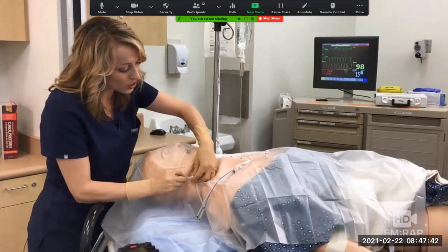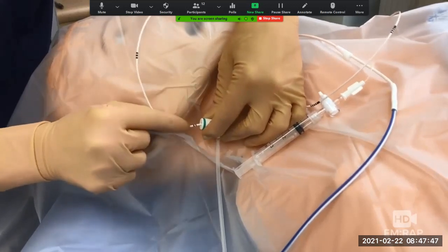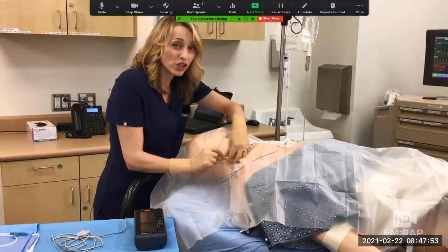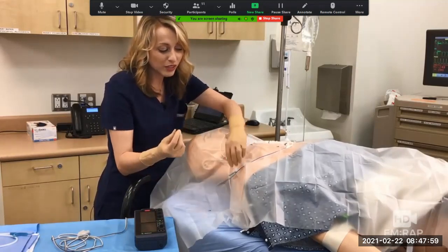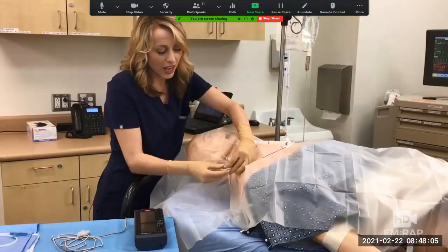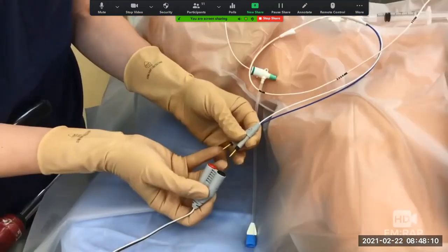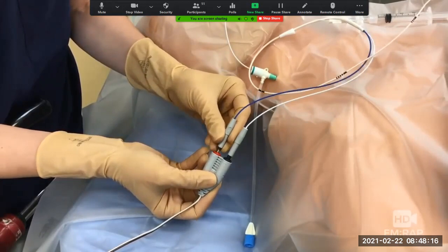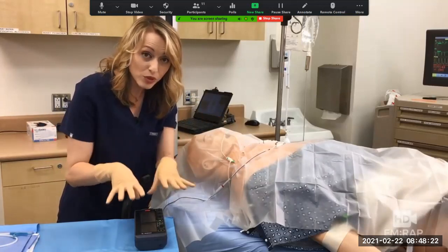So for now, you're going to continue inserting this wire until you get to the 20 centimeter mark, which is indicated by the 2 black lines on the wire. Now you know that the tip of your wire, and therefore the balloon, are just outside the cordis sheath. That's a good thing. We don't want to pop that balloon. Now we can connect the adapter pins to our pacing wire. And these are going to get plugged in to our connecting wire over here. And negative goes to negative, positive goes to positive. Remember, this is not sterile, so you want to have an assistant help you with this portion.